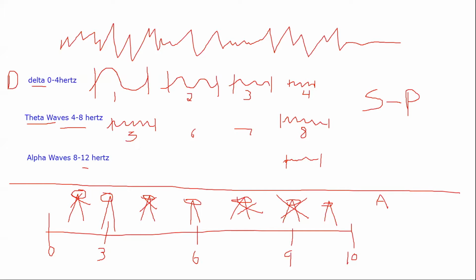So when we're looking at that theta, we want it to be not too much. So the marker for theta is 2.3, okay? And the marker where there's too much theta in that is when it crosses the line of 3.0.